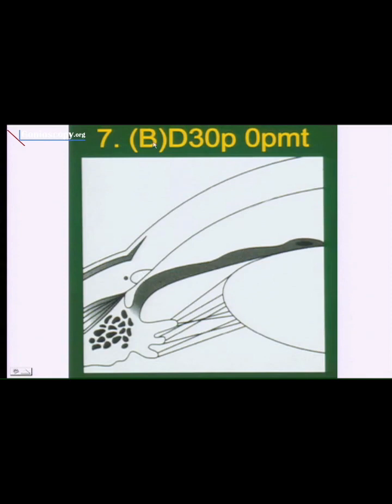But it's not a B angle. So this is put in parentheses, because in actuality it's a D angle, which you can only tell from Max Forbes' indentation gonioscopy technique. So when you push on the cornea, you displace the aqueous. This increased pressure here pushes this iris back. There's nothing to support it there. So the iris gets pushed back. You end up then with an iris that bows posteriorly. You know that's a D.